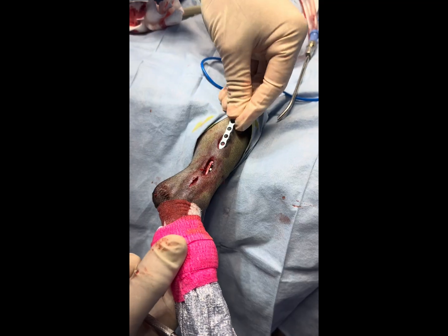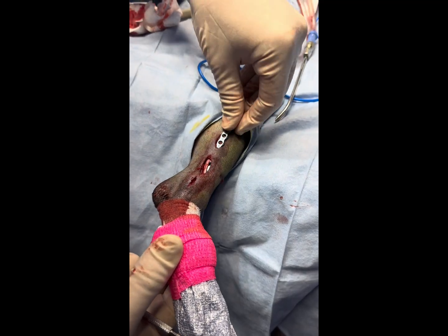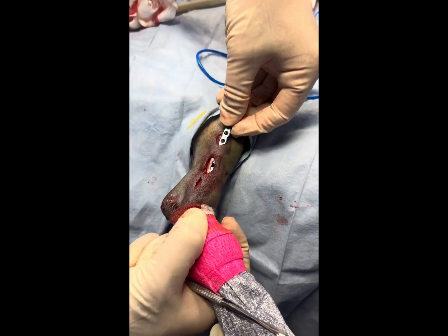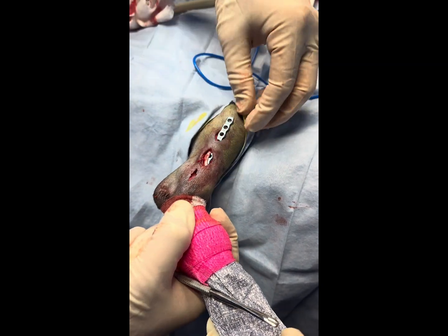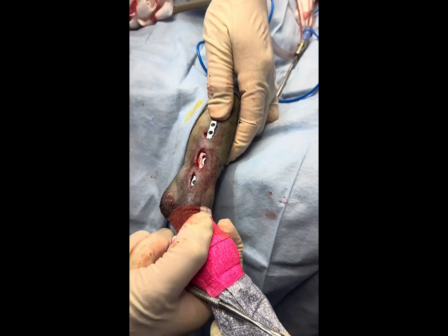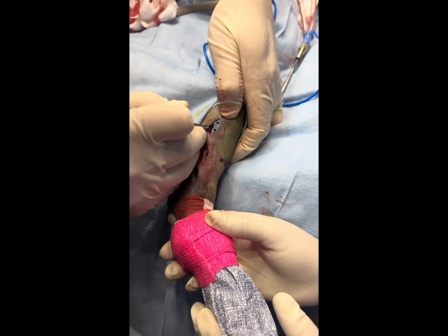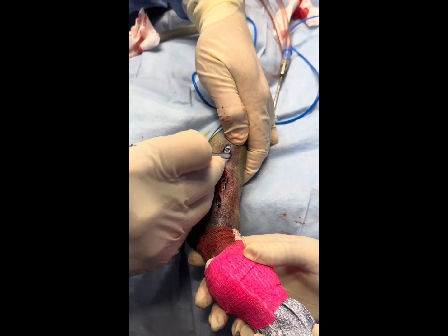I'll reduce the fracture once I get my plate in place, and we'll then put in the screws.